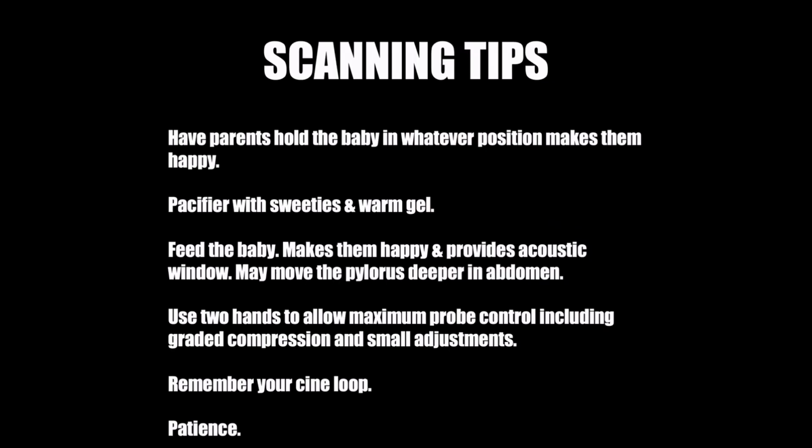Some general scanning tips when trying to evaluate for pyloric stenosis. Again, have your parents hold the baby in whatever position makes the kid happy. Definitely use a pacifier with sweeties on it, and always use warm gel. You don't want to have cold gel make your baby even more fussy.